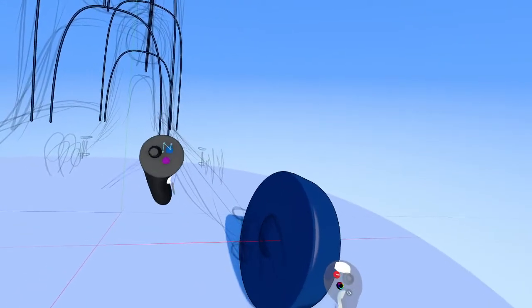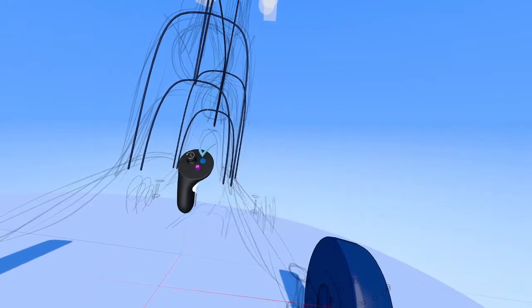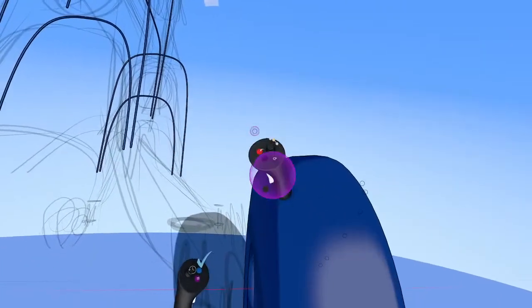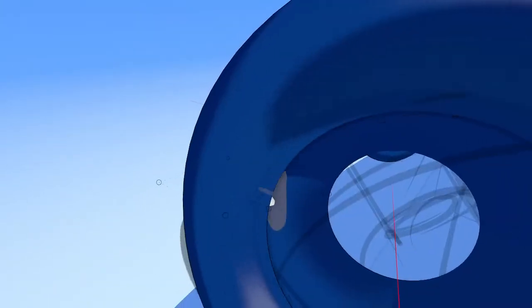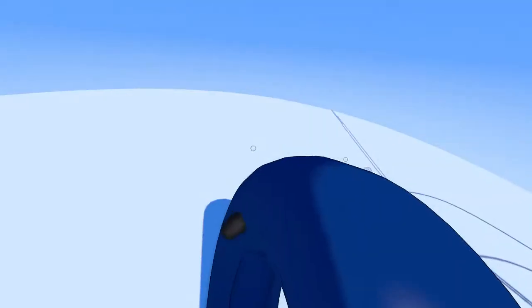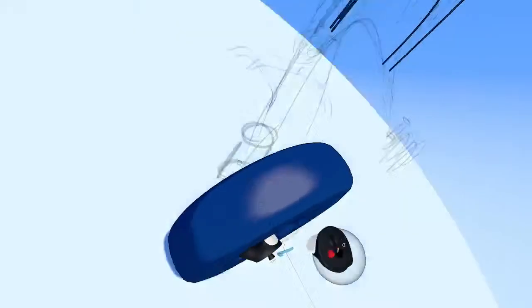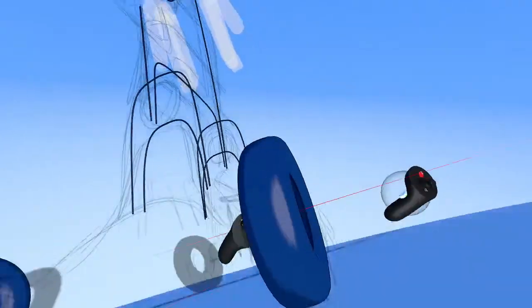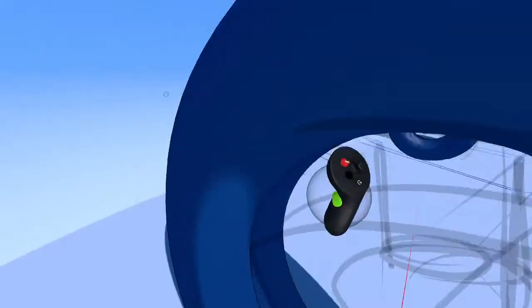Once I have that loose shape, grab it, hold it, put it into edit mode. If this menu gets annoying and you want to hide it, you can press the purple menu button here. That's going to minimize it. You're still in edit mode though. And once I've done that, I can actually come in here and start to shape these wheels. And we'll make them kind of beefy. Okay, great. So that's the tire section. This is the rubber of the wheel.